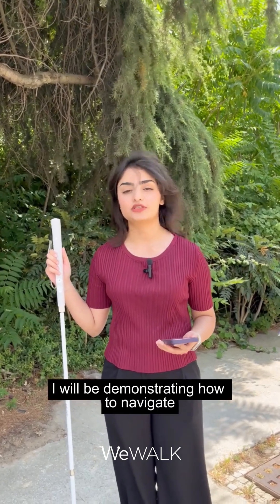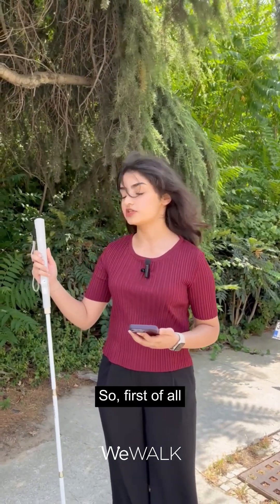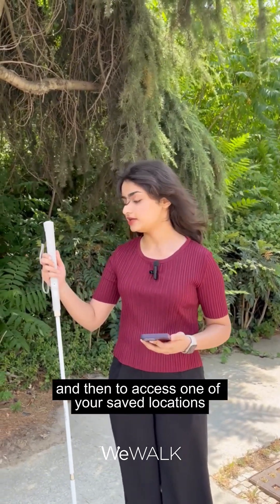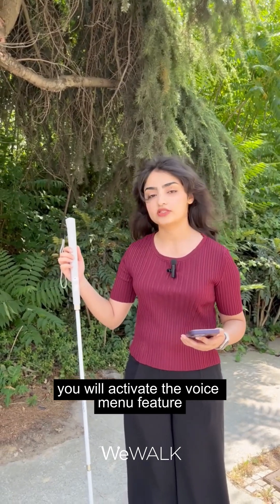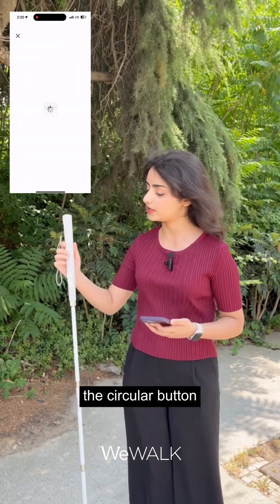Hi everyone, in this video I will be demonstrating how to navigate using the WeWalk SmartCane 2. First of all, you need to make sure that your cane is connected with the WeWalk app. Then, to access one of your saved locations, you will activate the voice menu feature, and to do that you will press the third button on the cane — the circular button.